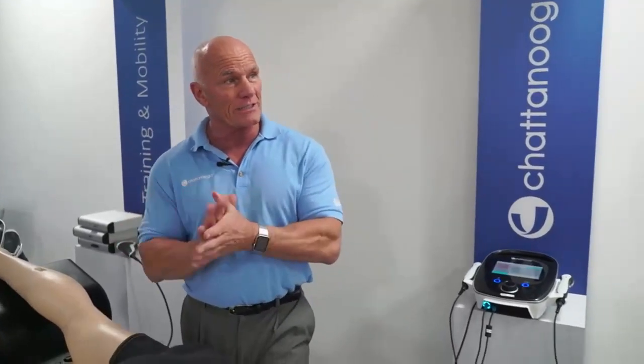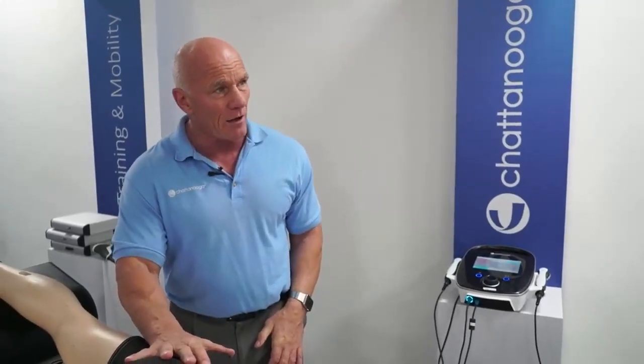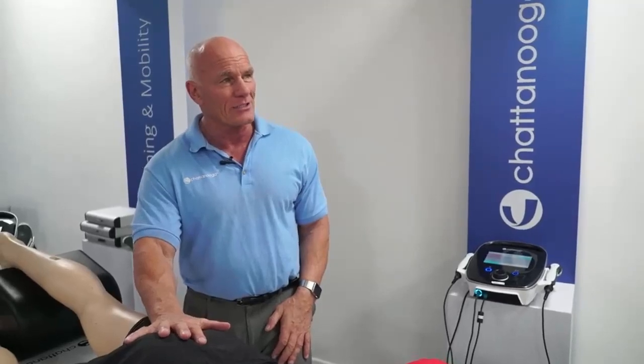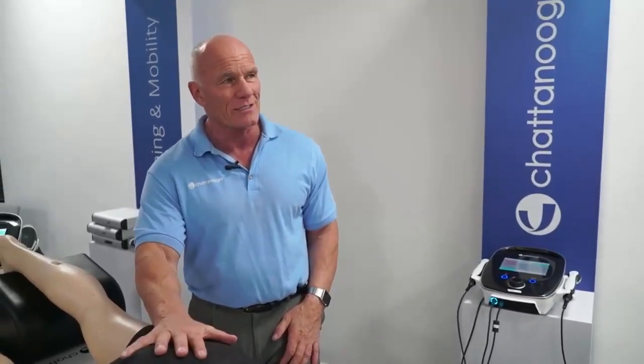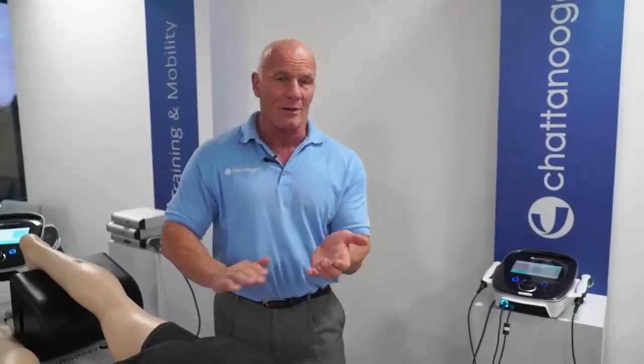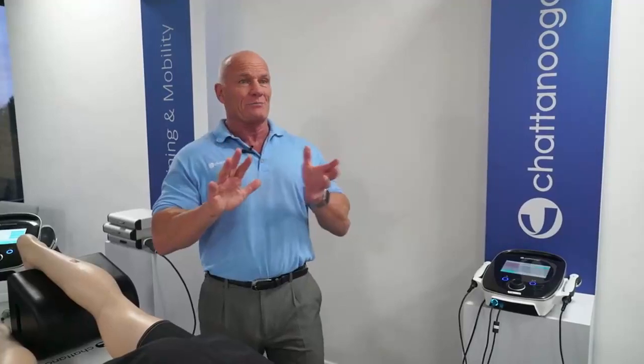But if I try to start at 4 and 5 bar, I'm never going to get my patient to accommodate to that. So if I came to you and I started bam, bam, bam, like this, your immediate reaction is, oh, pull away, that's painful, don't like it, your brain's on protective mechanism.